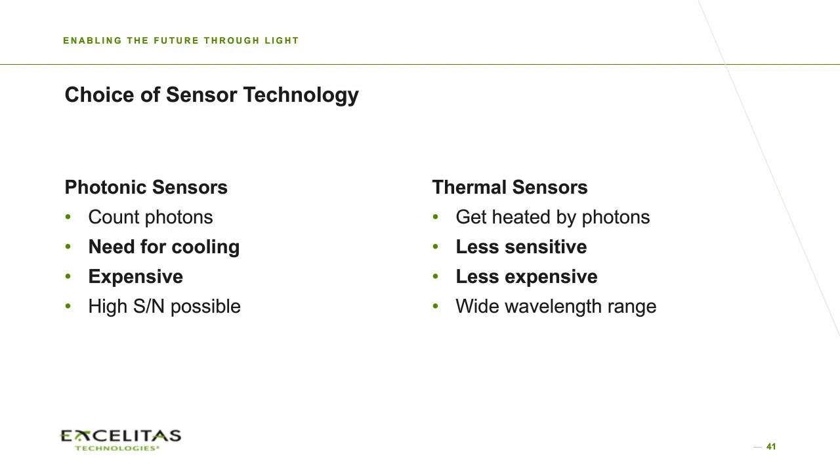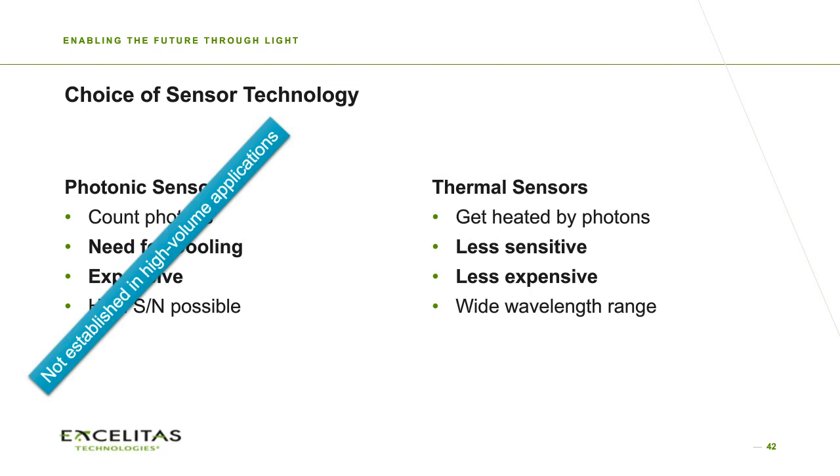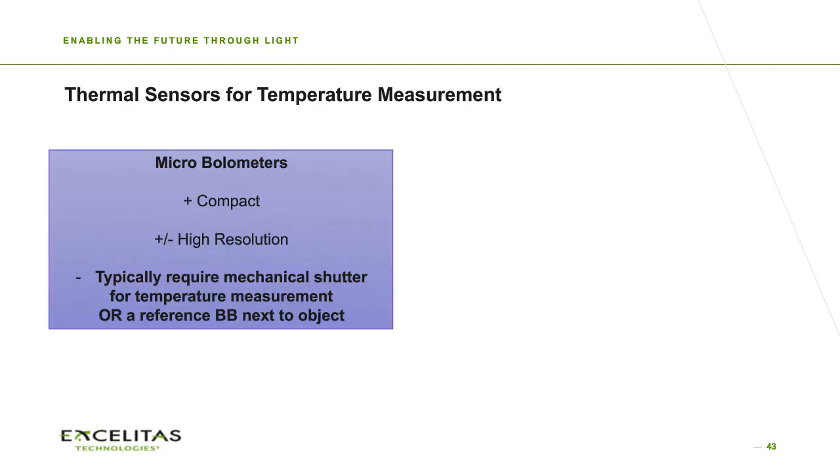So the photonic sensors are simply not established in high volume applications due to those reasons, for the high price, for example. Then, when you go to thermal sensors, most of you know those nice pictures with the false colors. Those are generally created with microbolometers. Those microbolometers can be very compact and have a high resolution. And this high resolution is, for some systems, even a downside.